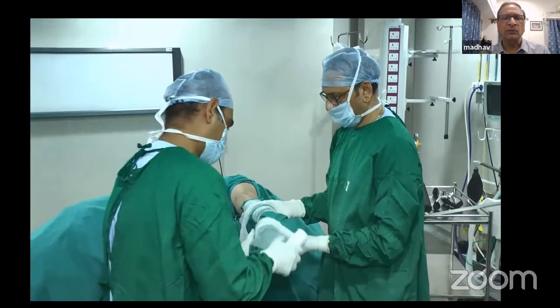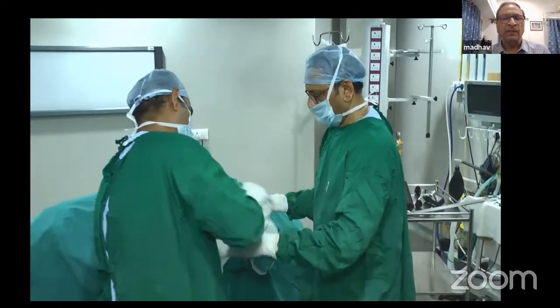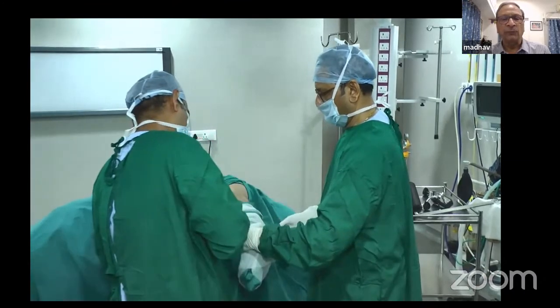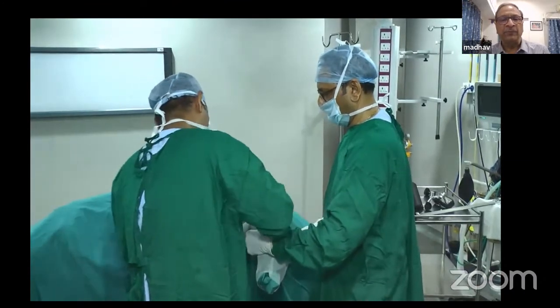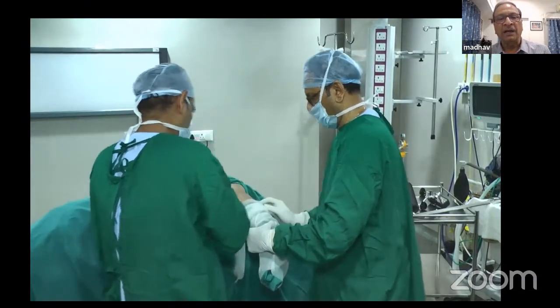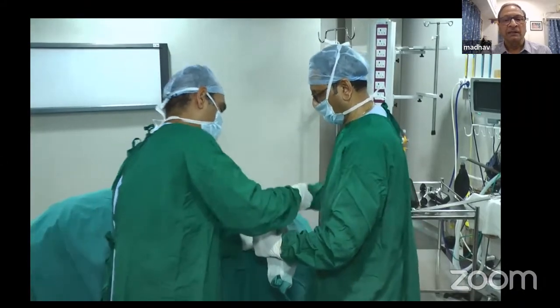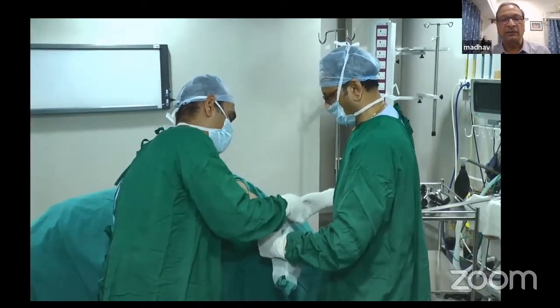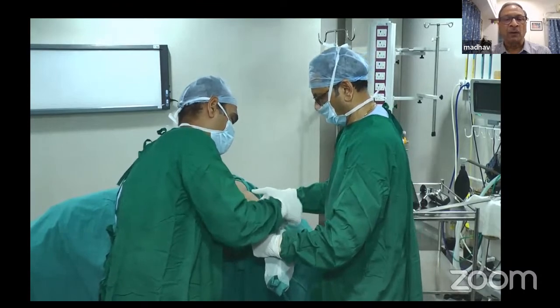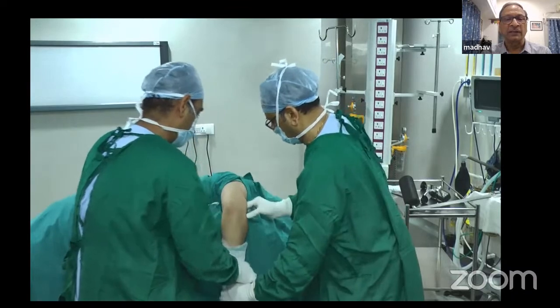So here, as you can see now, the area that is exposed is the upper third of the forearm posteriorly, the elbow posteriorly, and the arm posteriorly. As I said, this is the position which is required when you are operating on the humerus from the posterior approach, for distal end of humerus intra-articular fractures. So there you go.